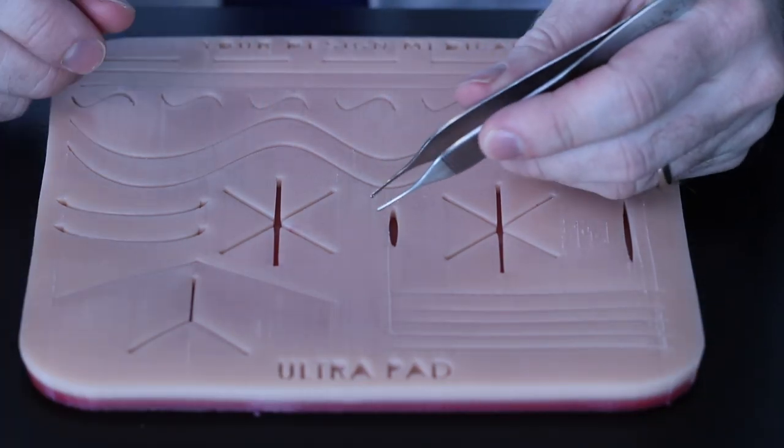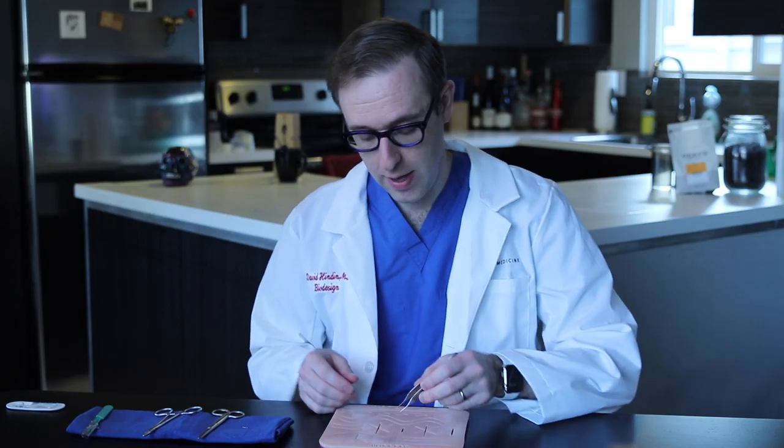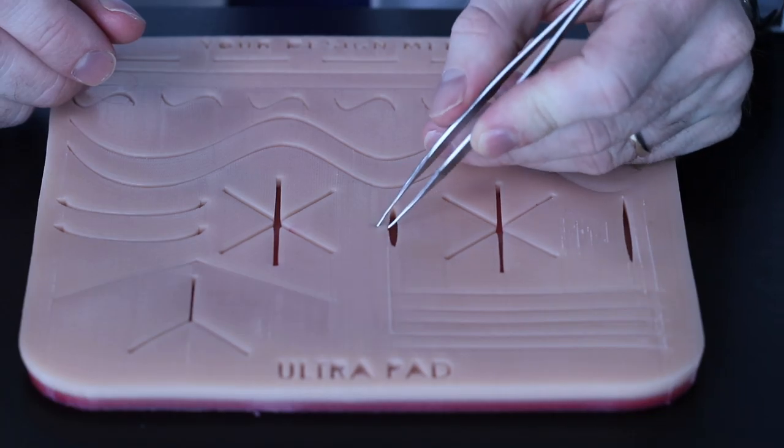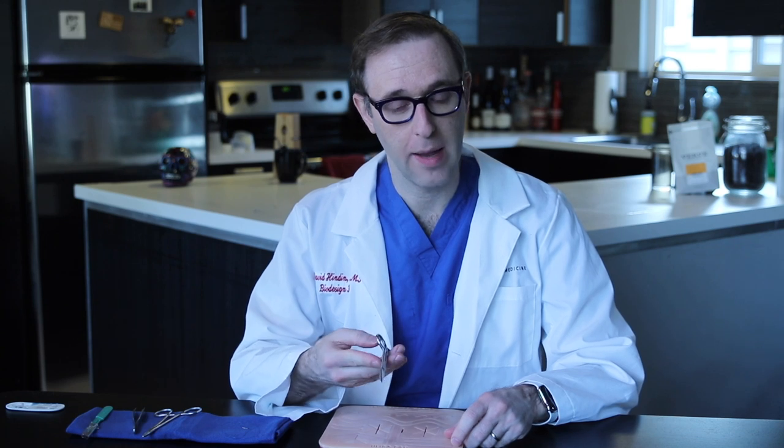The next thing you'll use is a forcep. This is what you use to hold the edge of the tissue. This particular one is called an Adson forcep, and we use this to evert skin tissue edges. You'll also need some kind of suture scissor. It's not very important what type it is, as long as it's a scissor that's big enough for the type of suture that you're cutting.